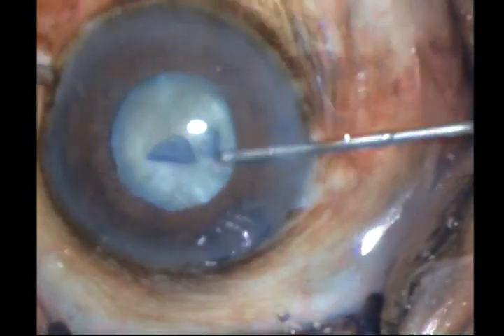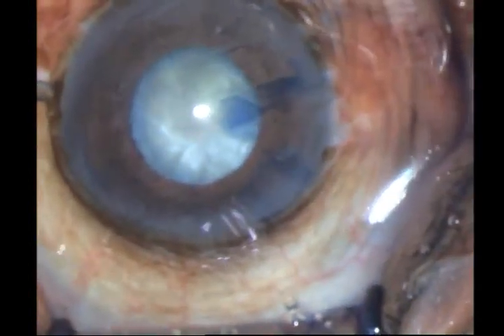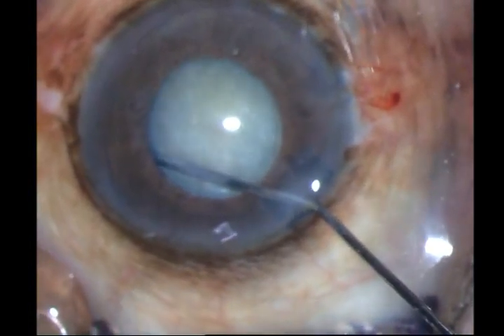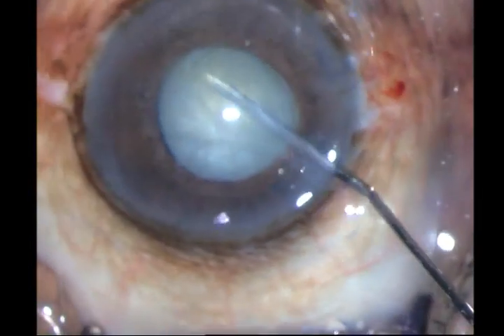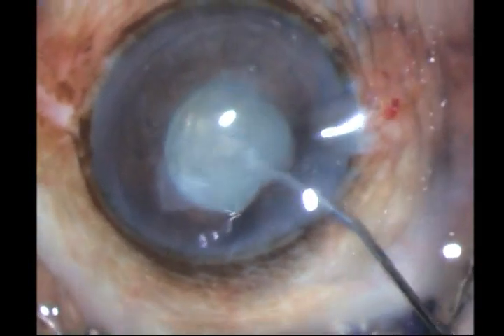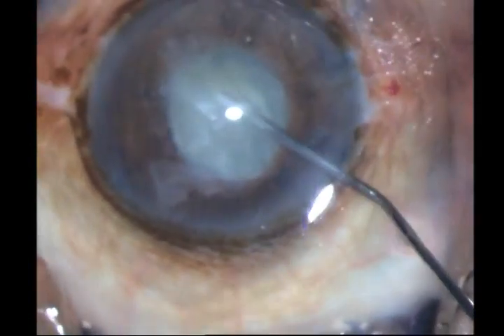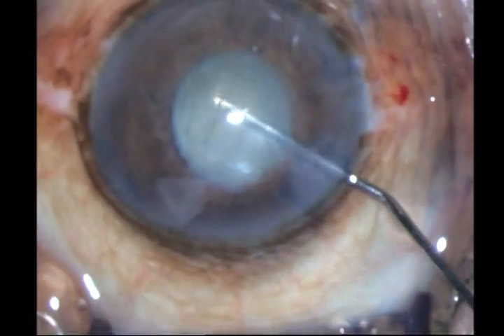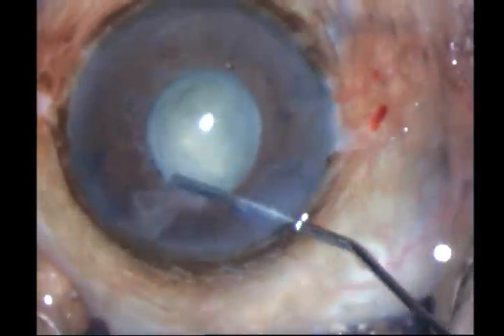Once I have done this, I go ahead and do a very mild hydrodissection. You actually do not need to, but this is mainly to kick up all the cortex which will come in my way of visualization later. So I just want to get rid of all this free cortex — I am actually just washing it out of the anterior chamber.